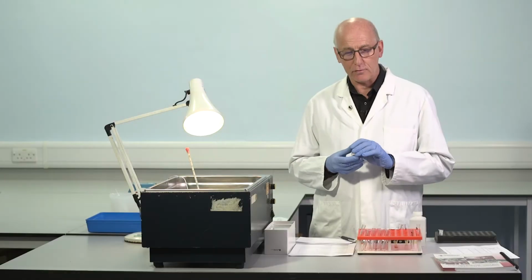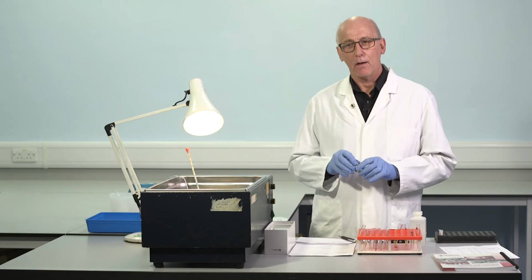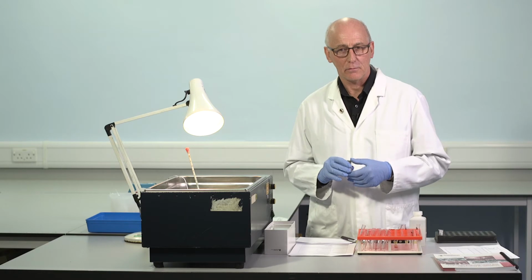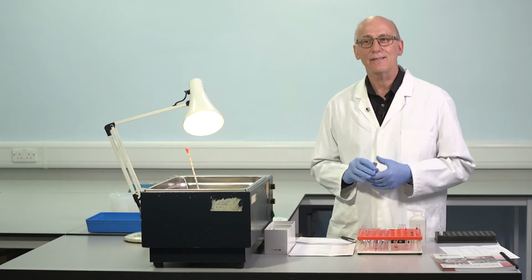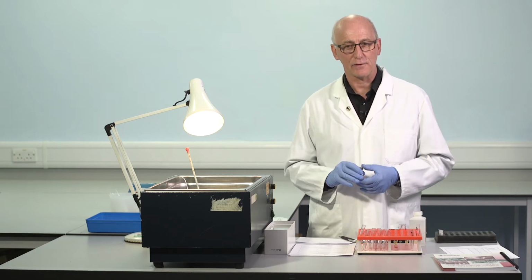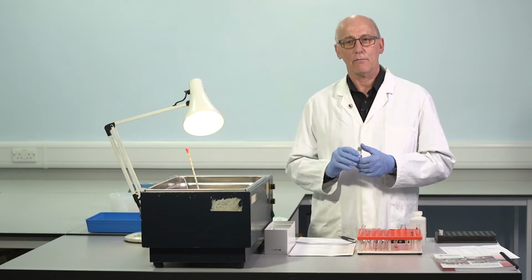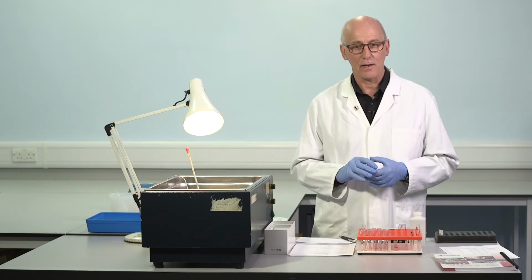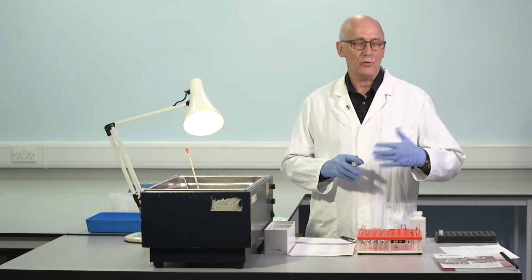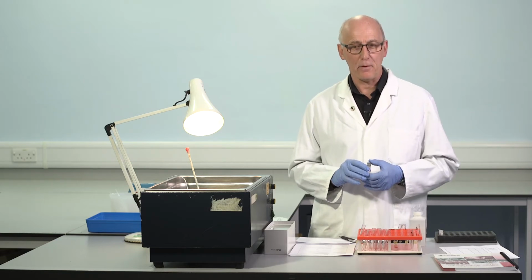So this is a commercial reference plasma, and it has a labelled potency. The manufacturer assigns the potency against a WHO standard, sometimes against an intermediate, a secondary standard, which itself is calibrated back to the WHO standard. And that's really important. It means that the reference plasma has a value, a potency, described in international units per deciliter, usually close to 100, or if you prefer, 1 international unit per mil.